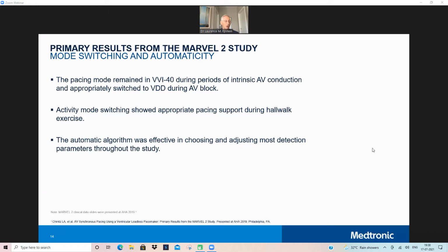But it works remarkably well in a lot of patients and often just requires minor adjustments. As Todd said, adjusting that A3 window to make sure that you're not impinging on A4 is probably the biggest one.